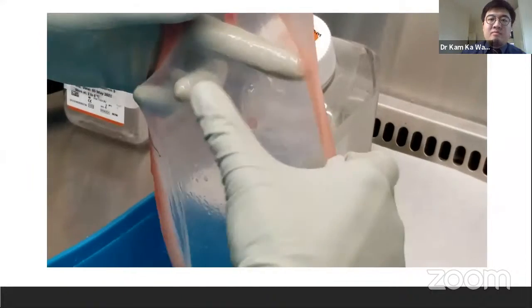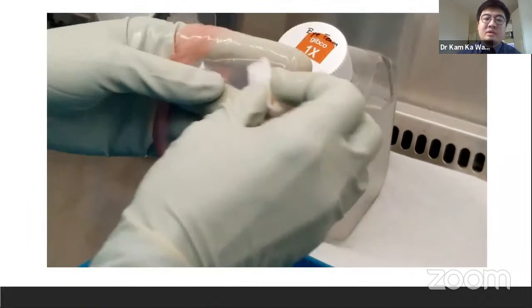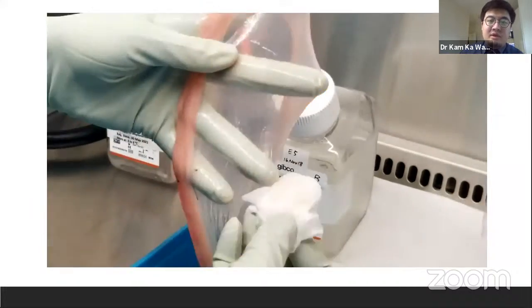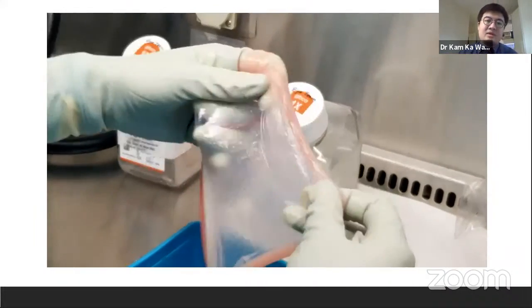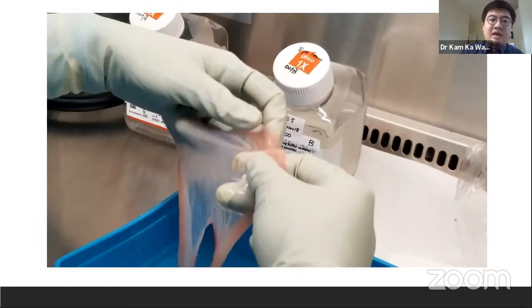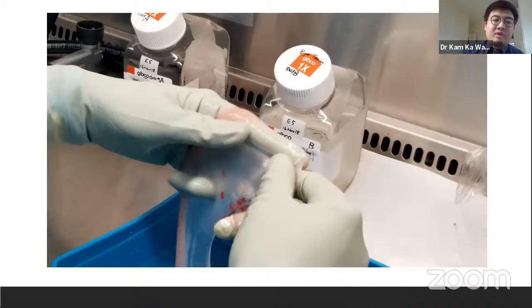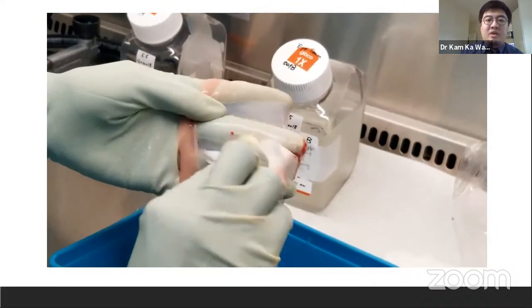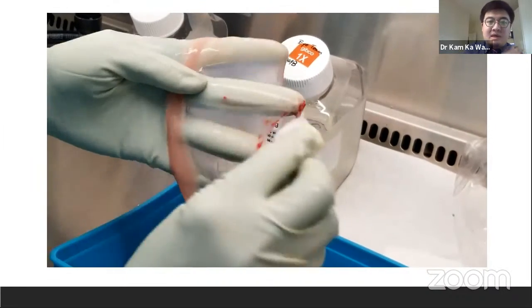Now you see that the membrane is not completely translucent. There is still some area of opacity. We're trying to rub it off from the surface. So be very gentle because the membrane is very fragile, and we wet it very frequently to avoid tearing the membrane. If we keep tearing the membrane, then we may not be able to utilize the entire membrane.